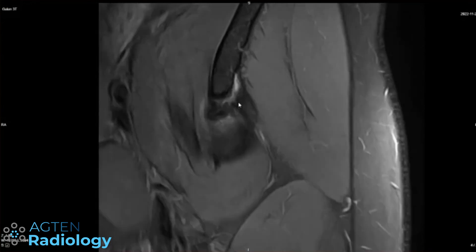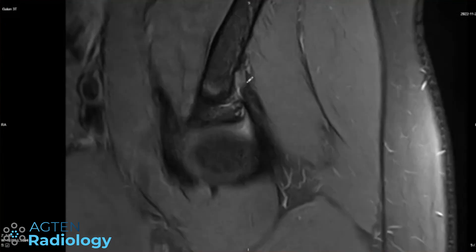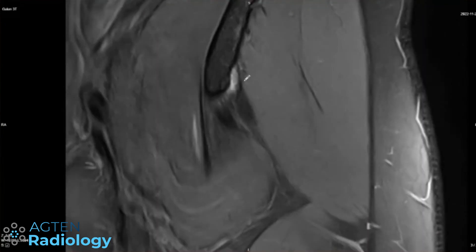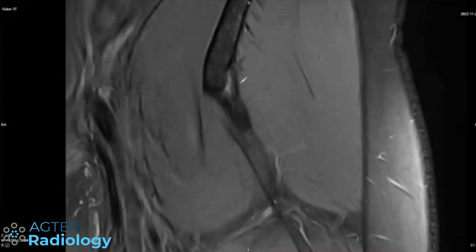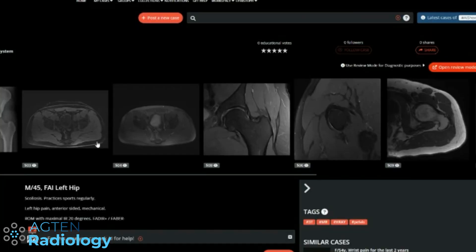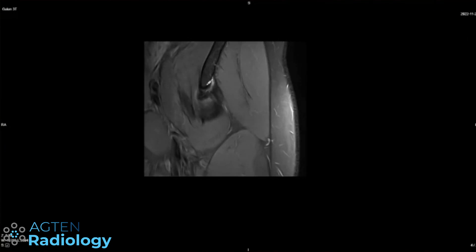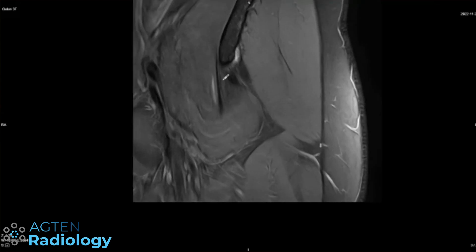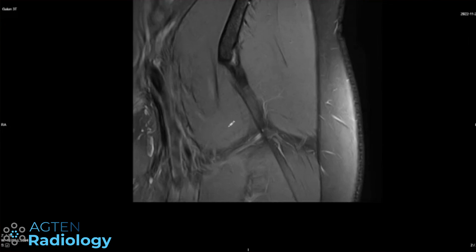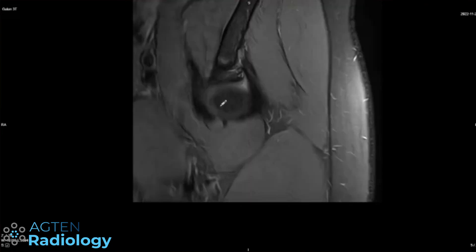Let's go to the coronals just to make sure we're not dealing with a vessel here — it's just behind the indirect head of the rectus tendon. We have the direct head and then the indirect head that goes posteriorly. If she's not having trauma, I don't think any stripping or anything like that is relevant. It's more a chronic situation. It's probably similar to what we see with the gastrocnemius tendons at the knee — a little fluid around the tendon origin. I would focus more on the iliopsoas tendon, or even the muscle itself, as the potential pain generator.